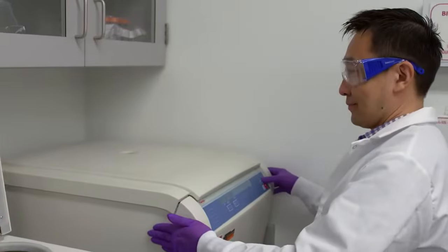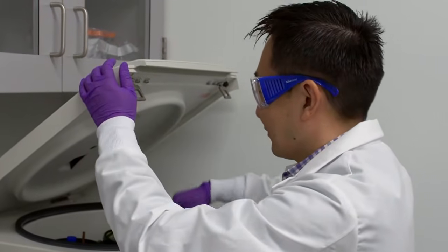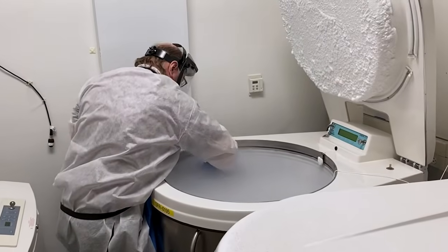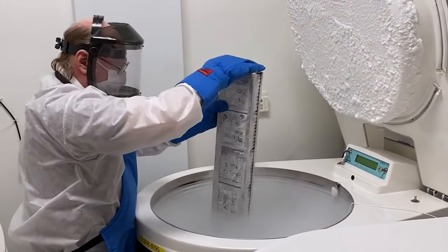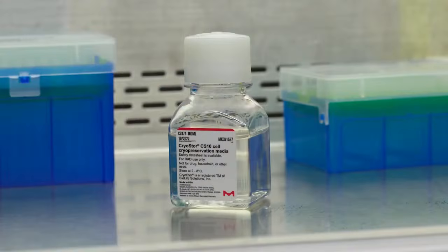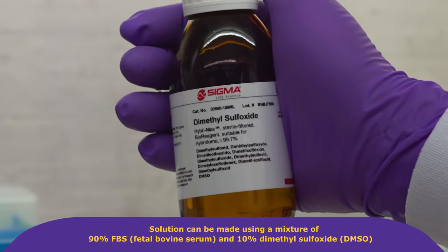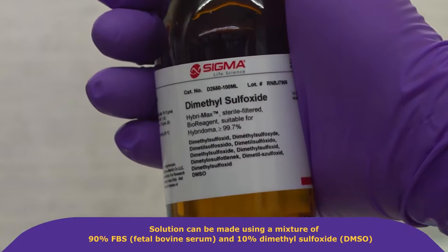To get started, always wear proper protection equipment to protect yourself from risk associated with mammalian cell culture and handling liquid nitrogen specifically. Cells are stored in freezing media. Commercial products such as CryoStar are available, or the solution can be made using a 90-10 mixture of sera and dimethyl sulfoxide, commonly known as DMSO.